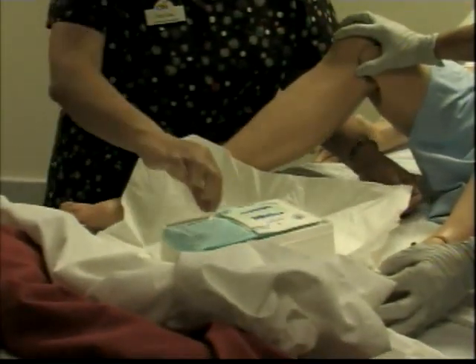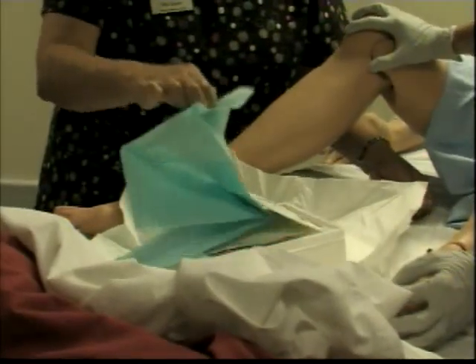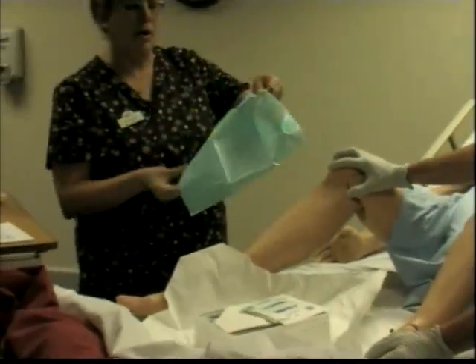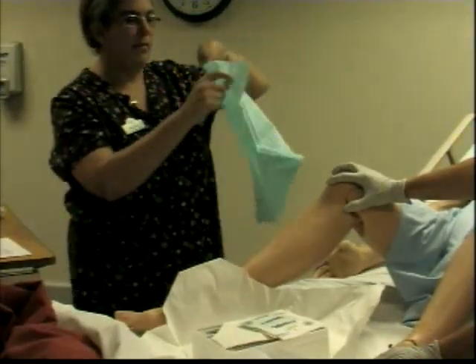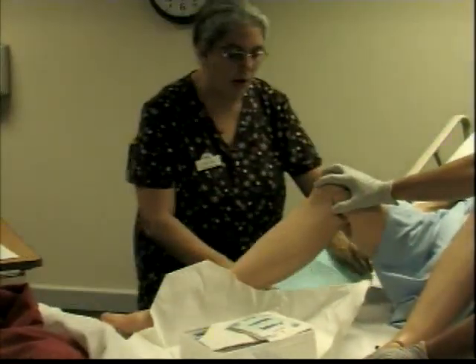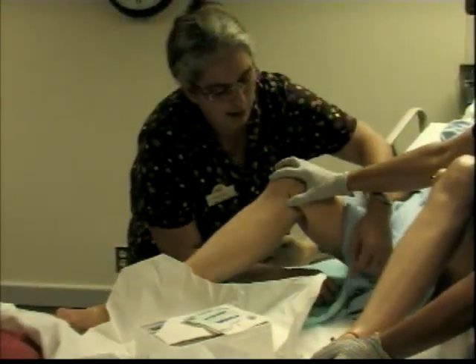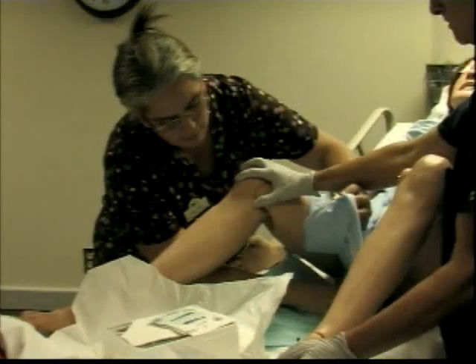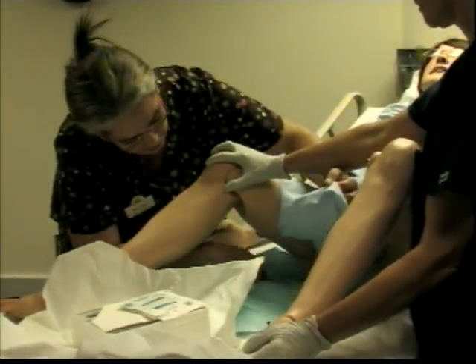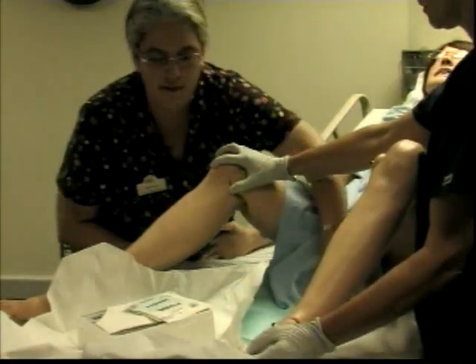This is one of the drapes you'll use on your client — the one that goes under the buttocks. Take it out; you see the shiny part — the shiny part goes down. Take it right underneath the kit, right underneath the patient, so it catches anything. But at the same time, maintain patient privacy.